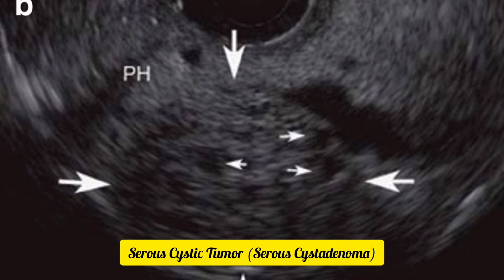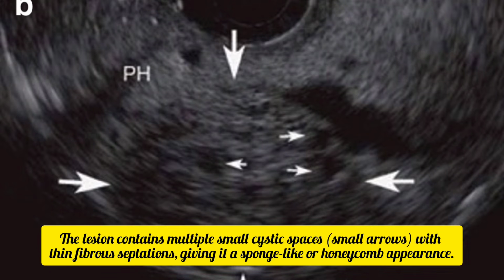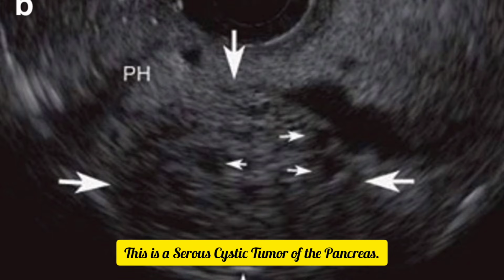Serous cystic tumor, serous cystadenoma. In this first image, you can see a multicystic tumor in the pancreatic head, large arrows. The lesion contains multiple small cystic spaces, small arrows, with thin fibrous septations, giving it a sponge-like or honeycomb appearance. This is a serous cystic tumor of the pancreas.